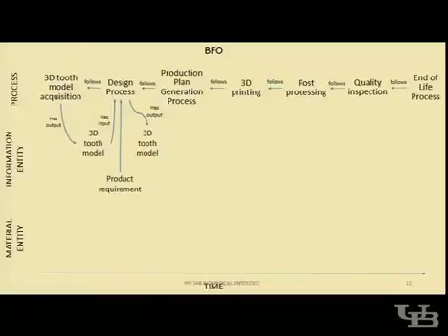Because let's say for this product requirement, you don't have to set it, but you need to refer to it. For example, the engineering drawing or the technical drawing. But for the process parameters, for example, you want to run the machine, you have to specify what would be the speed of operations, what would be the layer thickness of the operations, and so on. Okay, that's helpful.